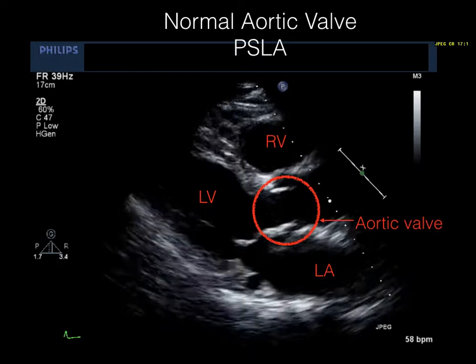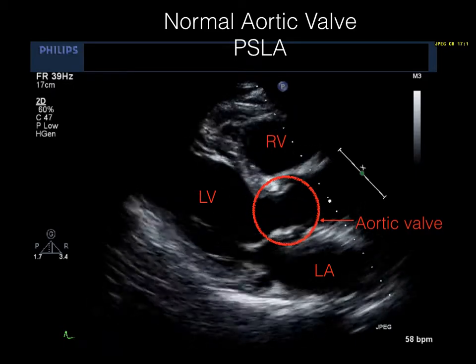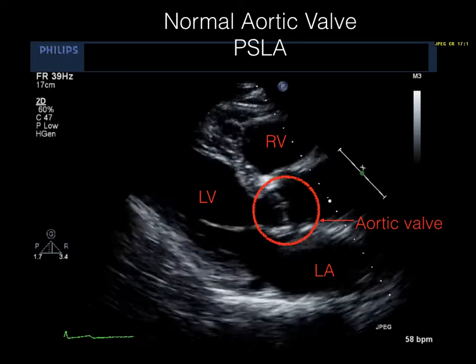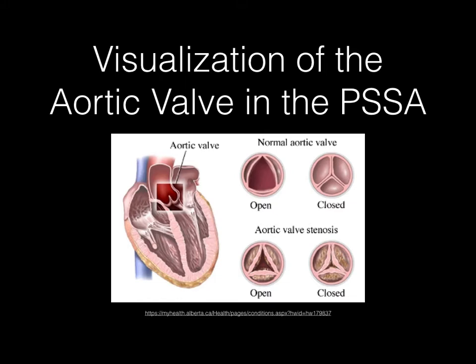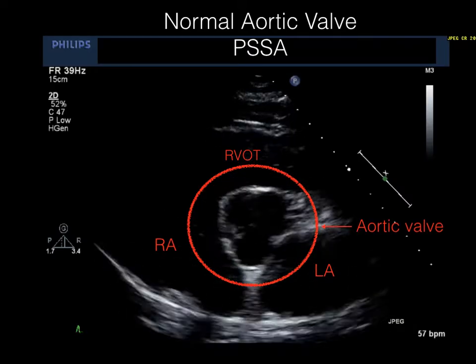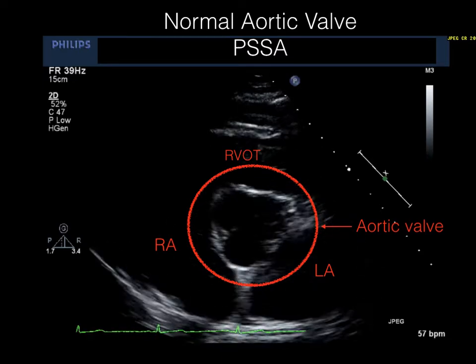Here we see a parasternal long axis view showing the aortic valve cusp movements. We can also look at the valve itself, a thin white line — this aortic valve is normal. In the parasternal short axis view, the aortic valve will look like a circular echoic structure where you will see the movement of the cusps opening and closing. To visualize the aortic valve in the parasternal short axis, you will need to tilt the probe just a bit towards the patient's chest wall. This is a parasternal short axis view showing the opening and closing of the aortic valve with normal cusp movements.